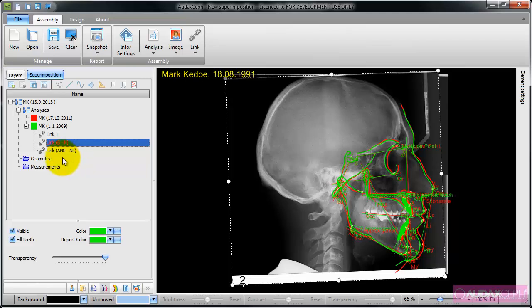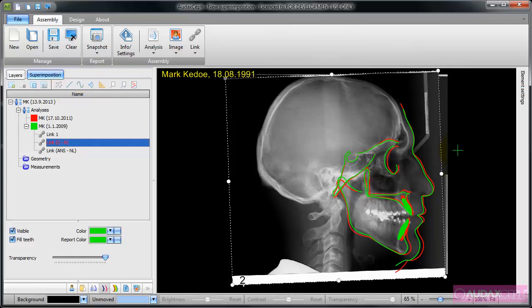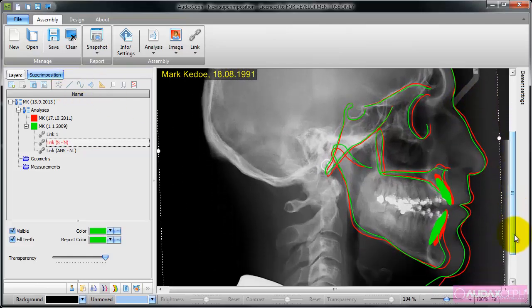If I want to hide all the points, I go to toggle points, toggle lines, and this is the superimposition that I wanted to have.